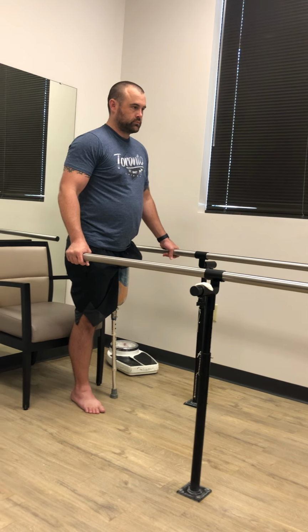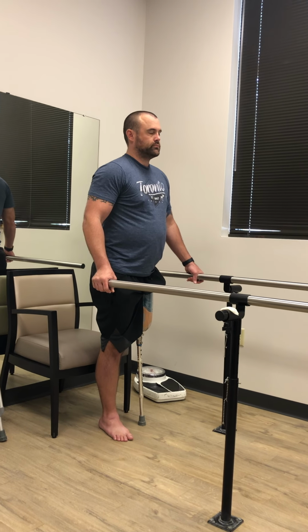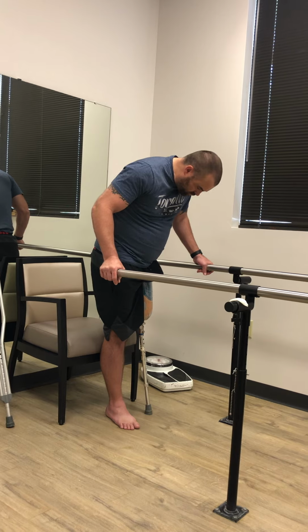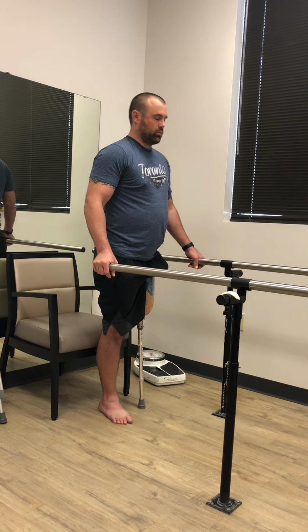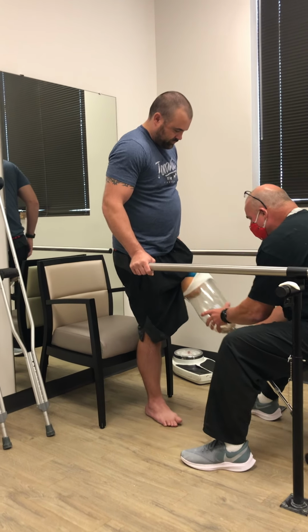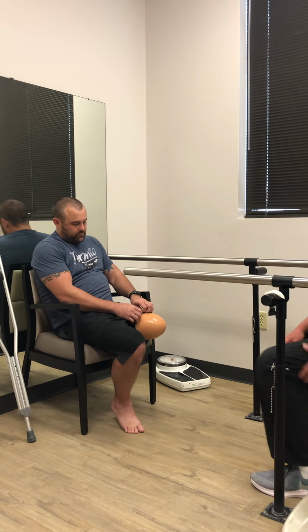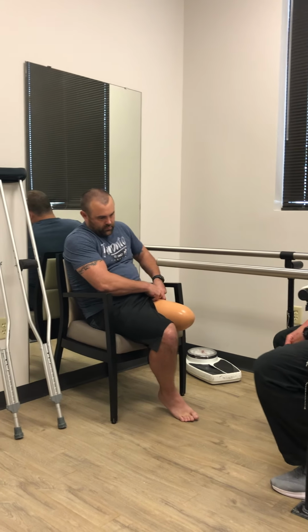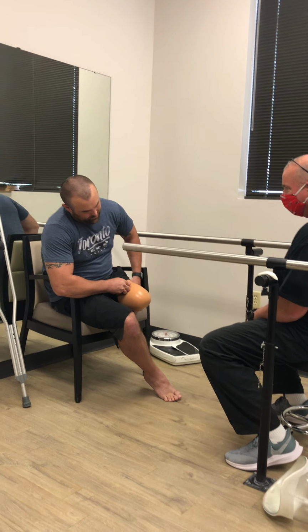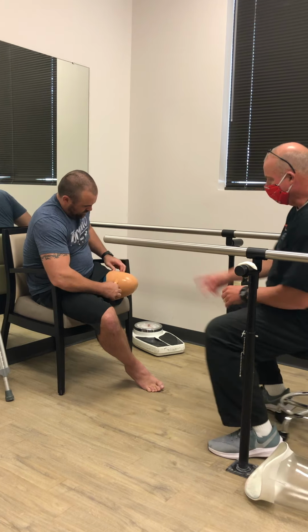Just have a little bit of excess in the bottom, it's not much. I think we'll be good. Looks fine. All right, awesome, easy enough. So I will get that boxed up, put all the coating in, get it sewn, and it'll just be a waiting game. In 12 days you're pulling off.